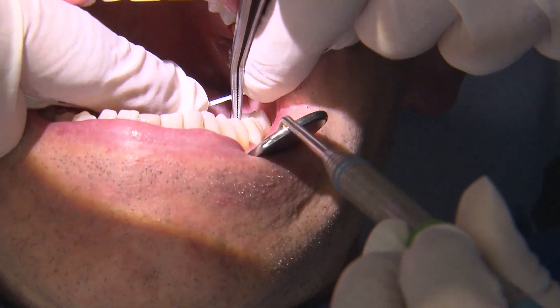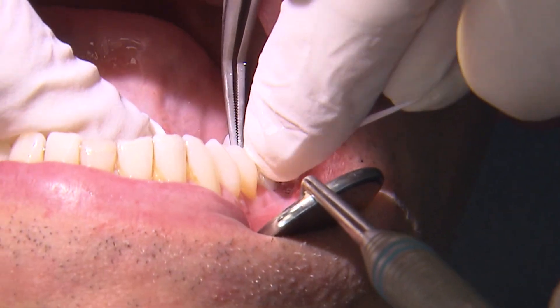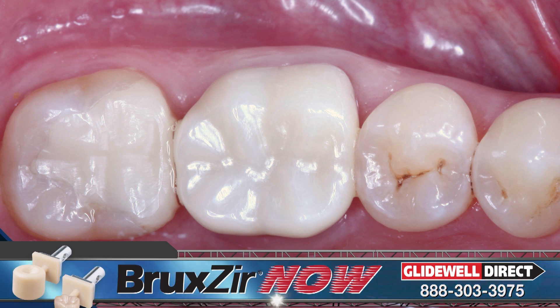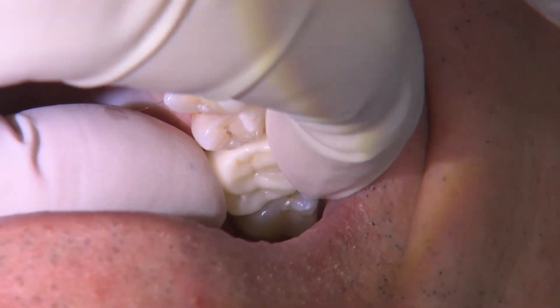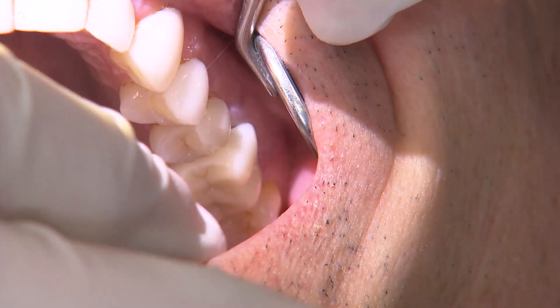When the correct parameters are dialed in on the software, there's very little to no adjustment needed to the proximal contacts. These restorations come right off the mill with a very nice surface finish. For the upper crown, I added low-fusing stain and glaze from the Obsidian CAD kit to show a comparison between the two finishing options.